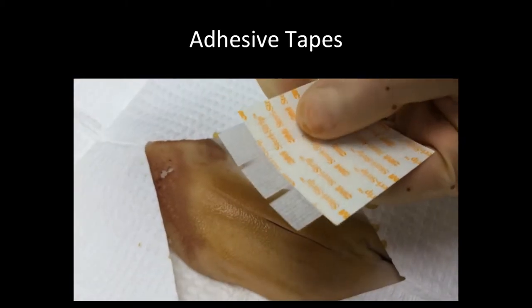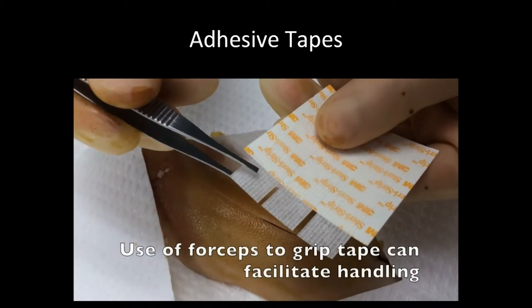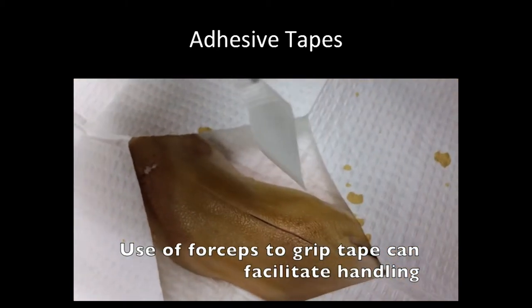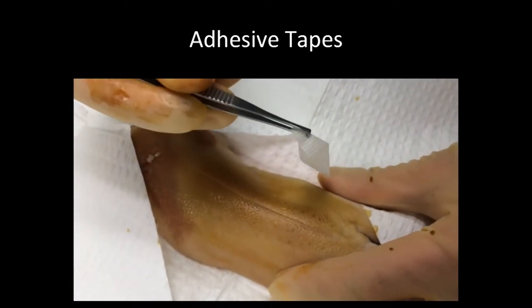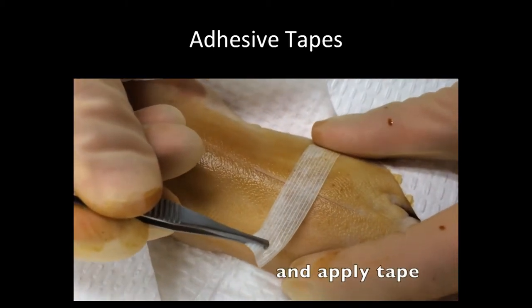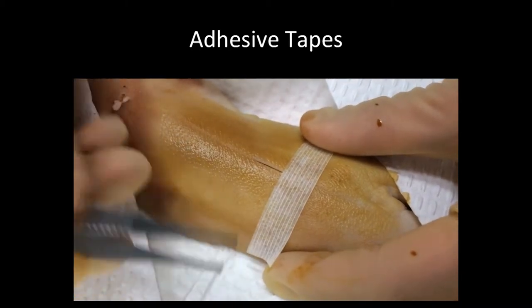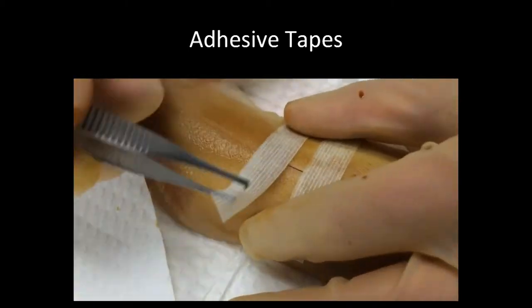Then you'll peel off the paper backing. And for ease of handling, it's often better to use your pickups to grab the end of the tape so it doesn't get twisted up in your hand. And then apply it across the edges of your wound. You're going to pinch the wound edges with your fingers in order to bring them together and apply the tape. You want to make sure not to apply it to one side and then drag the tape across, which can cause blistering of the skin.